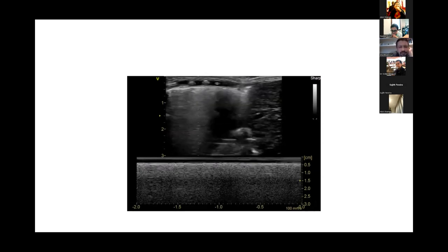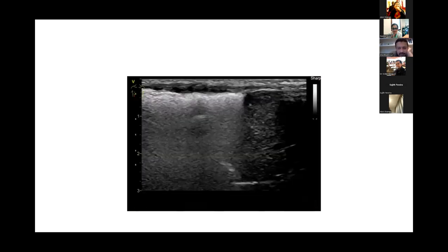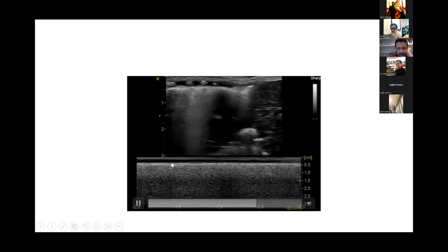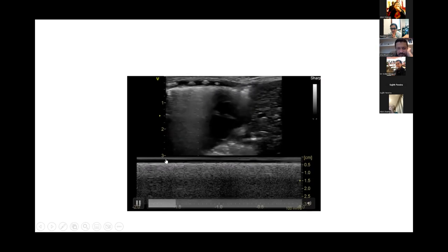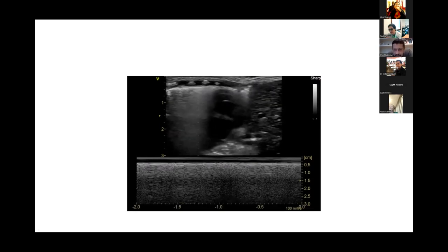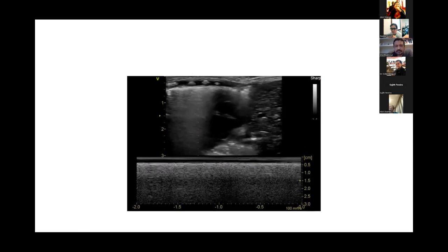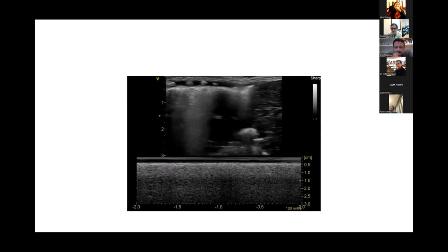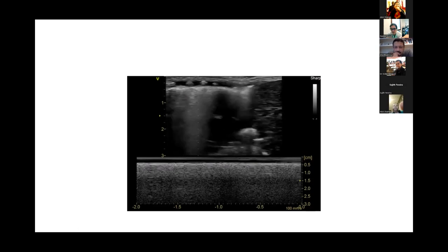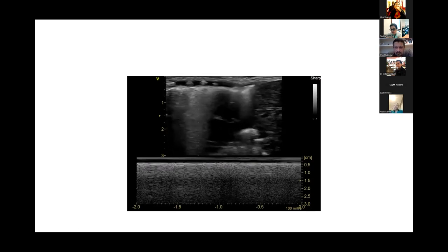Okay. So do you mean because of this black area? I'm calling it a black area, but if we go to the right side of your screen, still above there, you can see the horizontal lines. If you had that image all the way down, that would be a stratosphere sign. But here you don't. You have a clear difference in the upper part. And if you had possibly a larger area of subcutaneous tissue and so on, this narrow area would have been larger. But in any case, you have movement there.